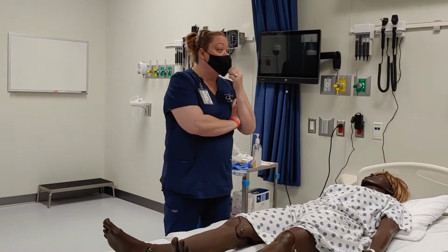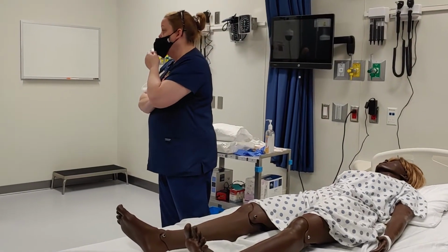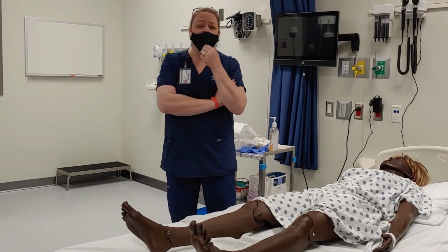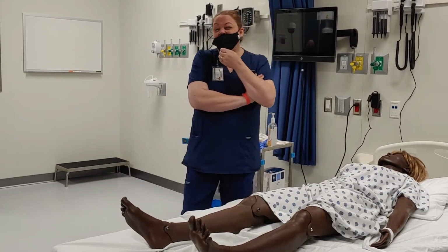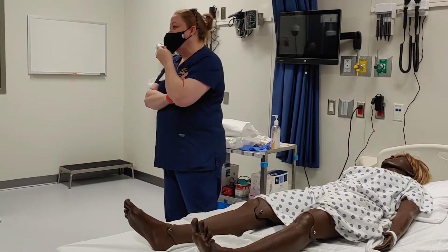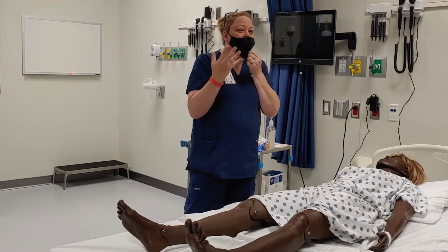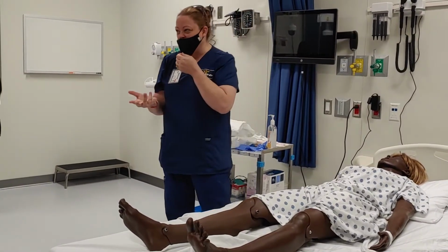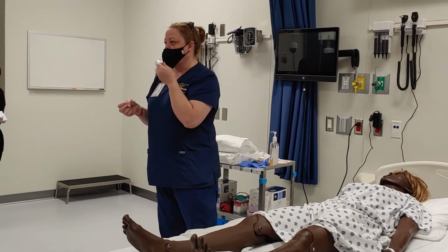So once I've come in, I've identified myself, I've identified my patient, they understand what we're going to do. I'm also going to tell them it's not a painful procedure. It's uncomfortable, and you kind of feel pressure, maybe just a little bit of stinging, but it's not a painful procedure, okay? So it's just kind of uncomfortable.